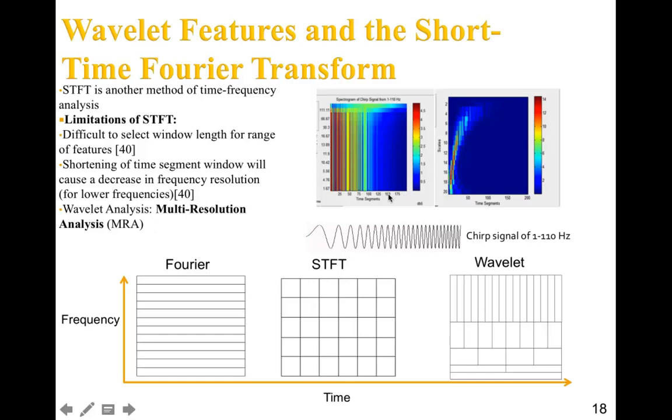And so if you just plot a simple spectrogram, you can see it gets kind of hard. We get pretty good resolution here, but then as time goes on and the frequency is getting faster, we just don't really see the whole picture of what's going on.